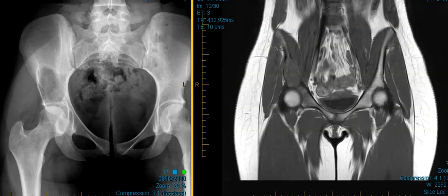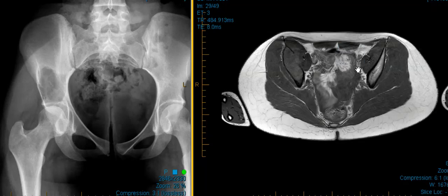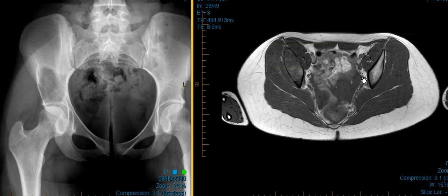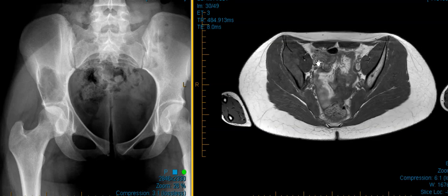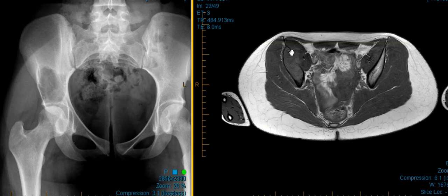Now we're going to put up another view to look at it from the axial plane. This is a view where the rectus abdominus muscles are up front, this is the back, right side, left side, and we see that the lesion is expansile. The medial cortex — we don't see the medial cortex. The black line is the cortex, and we just don't see it in this region.